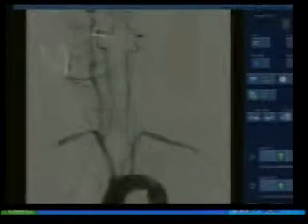We draw a line perpendicular to the inferior arch, to the bottom side of that arch, and draw a perpendicular line across the top of that arch, and anything that's above that line is a very favorable arch for us, such that we can go from the descending aorta with a fairly straight shot. So I think you can see in all of these vessels that we have a fairly straight shot to the right and left internal carotid artery.